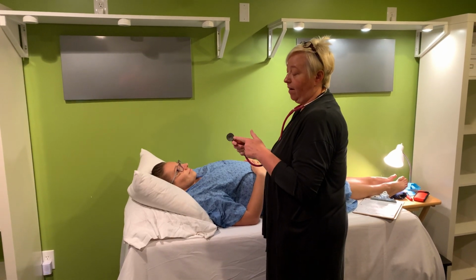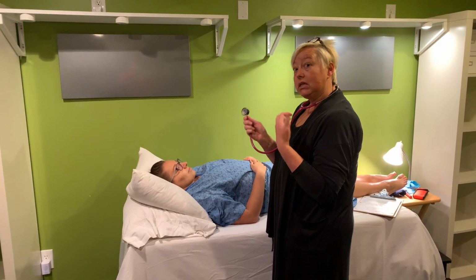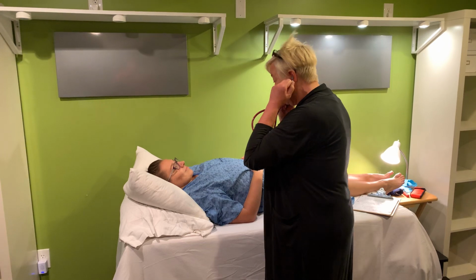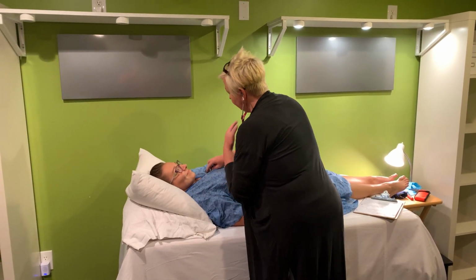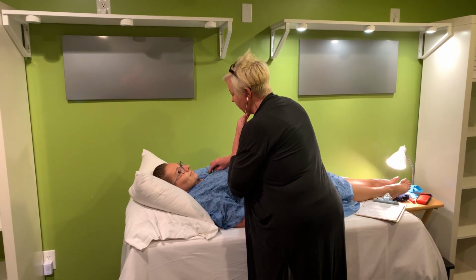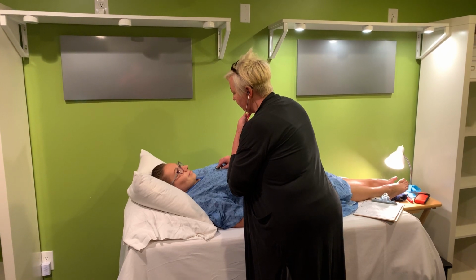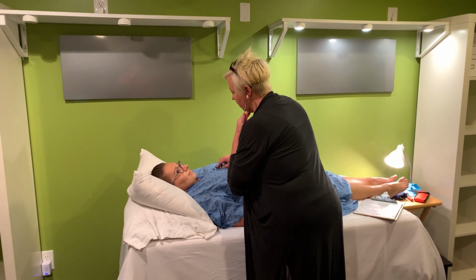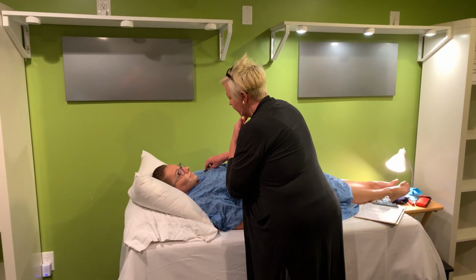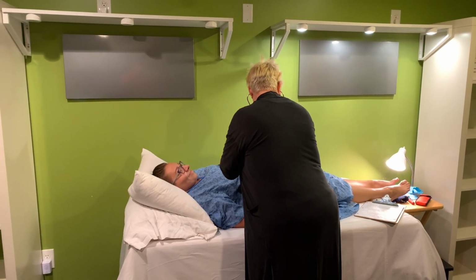When we listen to heart sounds, you listen with the diaphragm as well as the bell. So I'll listen with the diaphragm first. I'm going to be listening to that lub-dub sound, which is the S1 and the S2. And I can hear it very clearly in there. Then I go over four points just to make sure that I get all aspects of that heart. All right, Ashlyn, that sounds normal. Perfect.